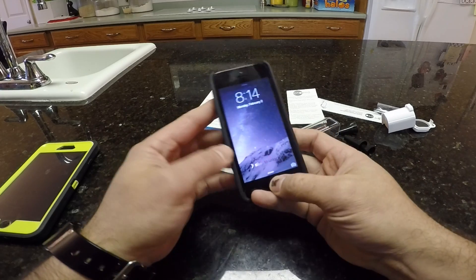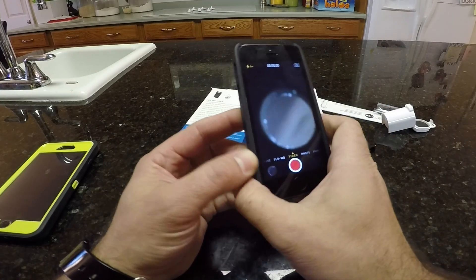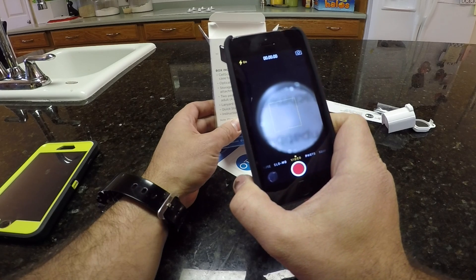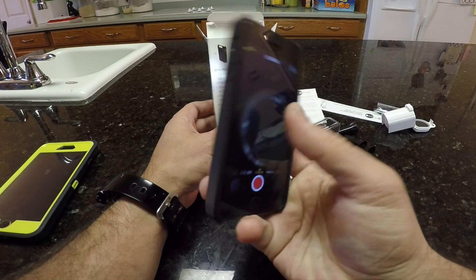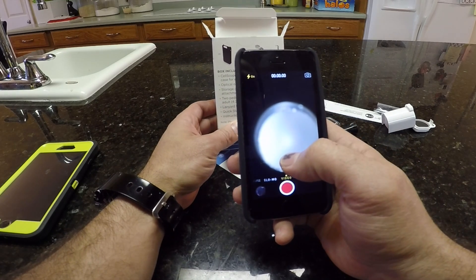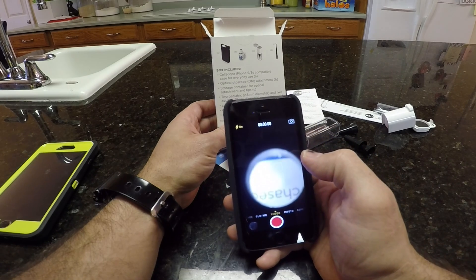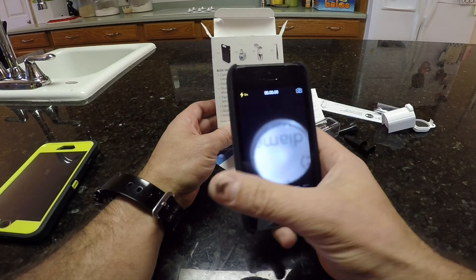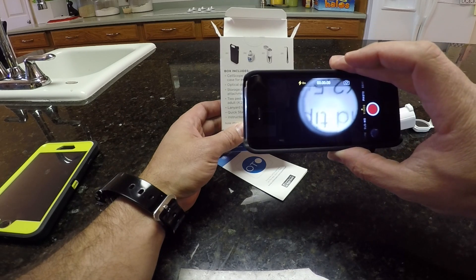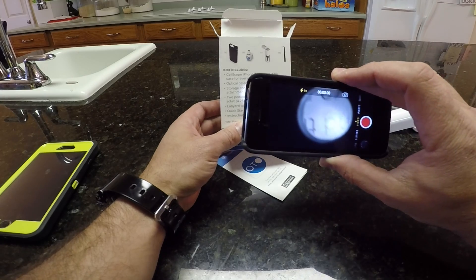So I'm pretty happy with the image it produces. Obviously, I would use this on video mode most likely — turn the flash on so you can actually see. I do not like that when you're doing this, it flips the image upside down. Like I'm going down but the letters are going upside down. Now that shouldn't play a big difference when you're looking at the ear sideways like that, but it is confusing — you want to see up, but you actually have to aim down and it's going to mess it up.